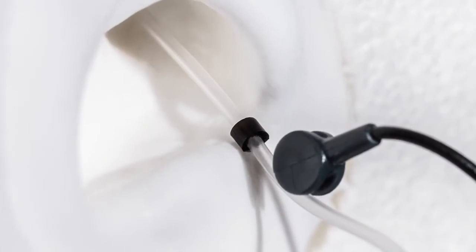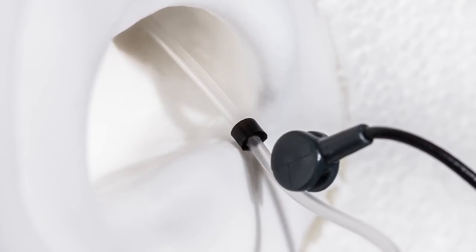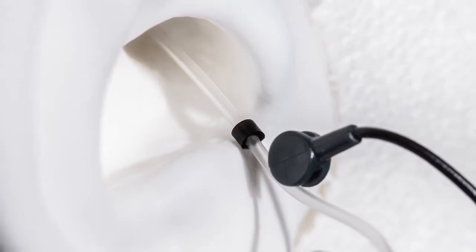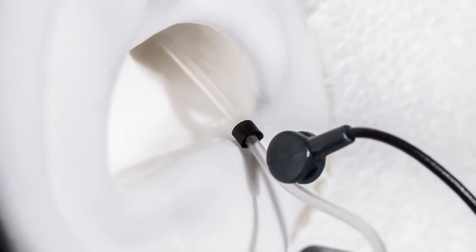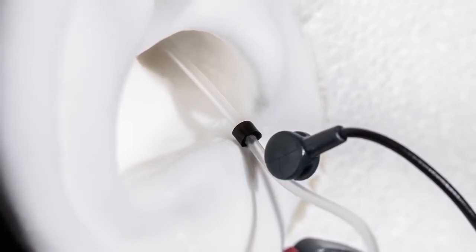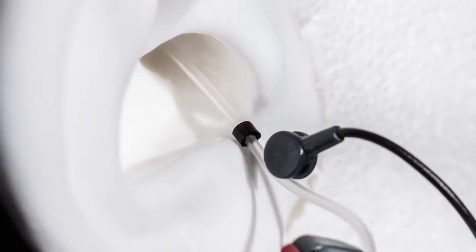For insertion of the probe tube, use the probe tube holder to guide and fixate the tube into the right position, as shown in the picture. It is best to press the tube slightly from below into the notch of the circular probe holder. Then move the tube with the holder into the ear canal. After insertion of the probe tube to the correct length, the marker should be positioned right at the tragus notch at the ear canal entrance.